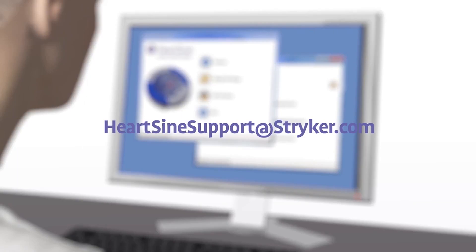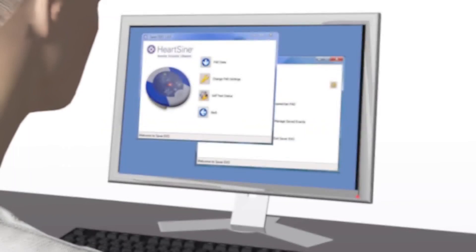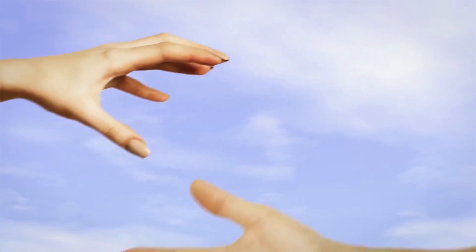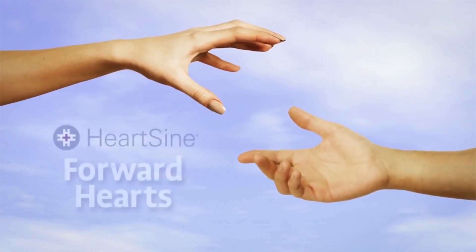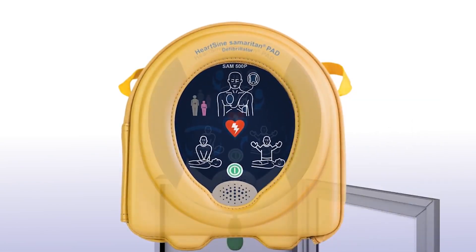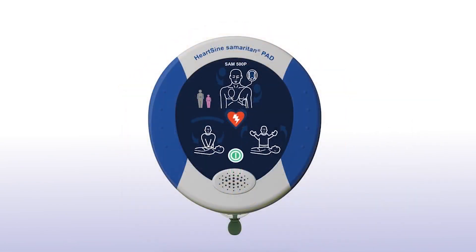After downloading the event data, please erase the data from memory. If you need assistance to do this, contact HeartSign Technical Service. When a HeartSign Samaritan PAD is used to save a victim of sudden cardiac arrest, the survivor is eligible to participate in the Forward Hearts program, which provides a donation to an organization of the survivor's choice. Contact HeartSign for details. With the unit nearby, you are always prepared to respond in the event of someone going into sudden cardiac arrest.